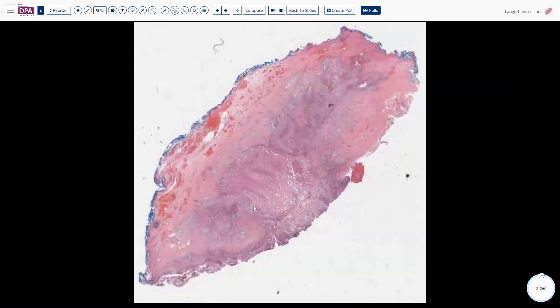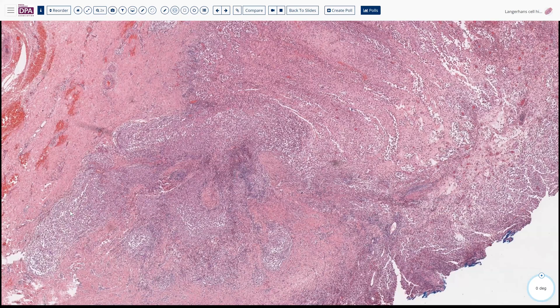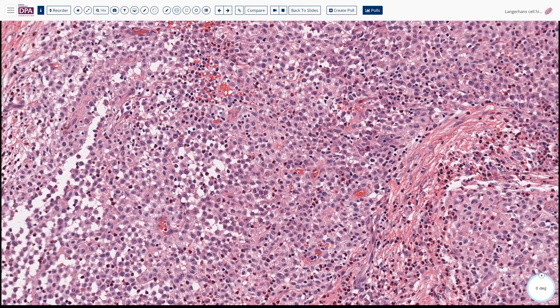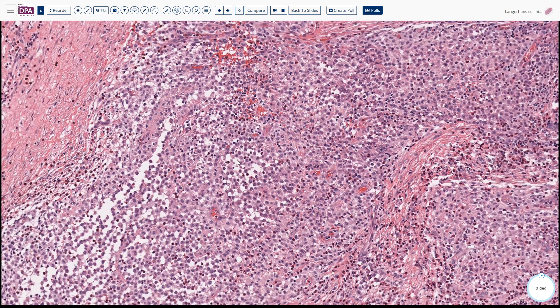An additional lesion is included because this entity is very common in the skull. This sample grew out into soft tissue, showing variable morphology with abscess-like extensions of mostly single, loosely cohesive cells generously sprinkled with eosinophils. Higher magnification reveals nuclear grooves, demarcated cytoplasmic borders, and higher nuclear-to-cytoplasmic ratios than typical histiocytes.